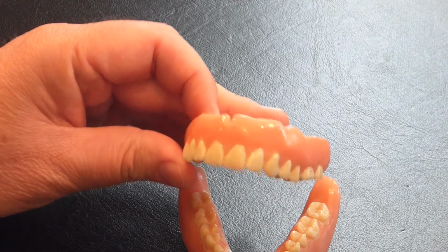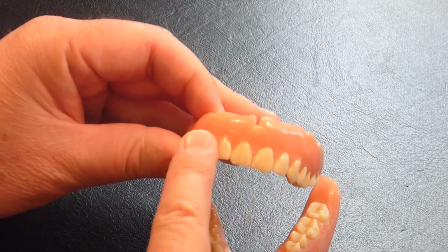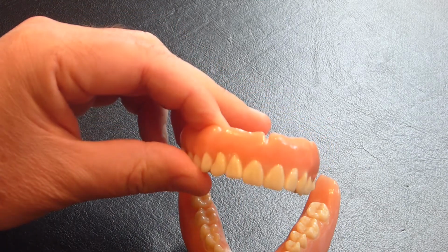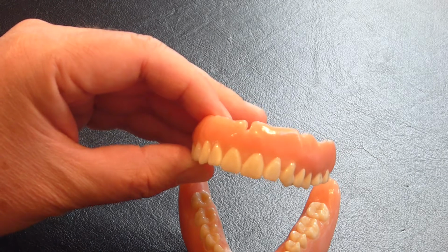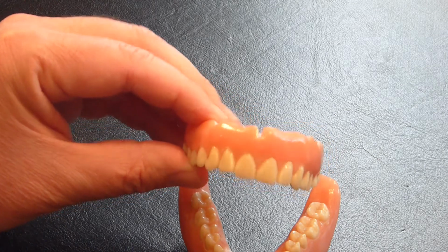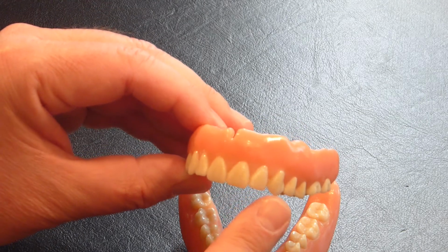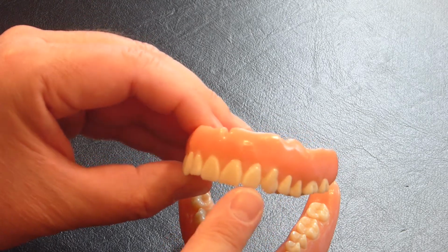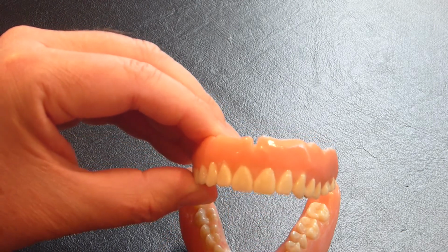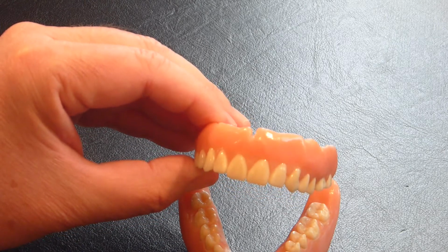The dentures can also be customized. Can have different size teeth, different shapes of teeth, different colors of teeth. Can even arrange the teeth differently. In this situation, this setup is a more youthful setup where the teeth are all kind of different lengths. The two front teeth a little bit longer, two teeth next to them a little shorter, and then the eye teeth tend to be a little longer again.